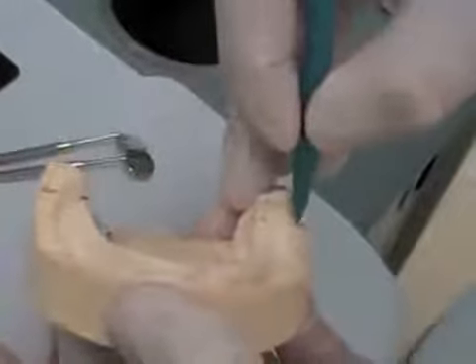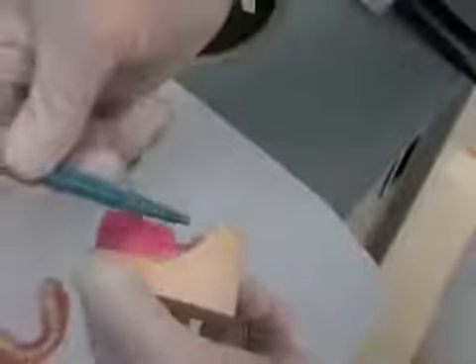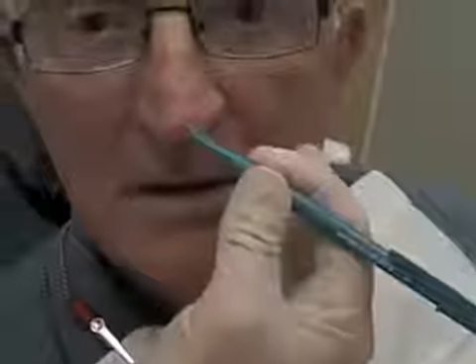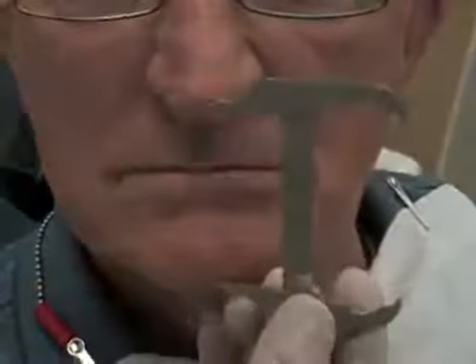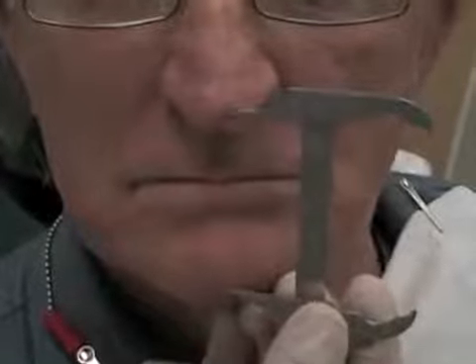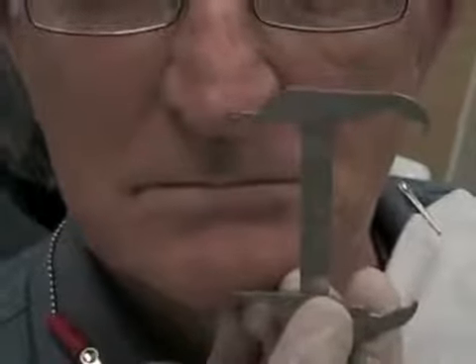Here we're marking halfway up the retromolar pad and transferring it onto the land area. We'll reseat the wax rim on the cast and use an instrument such as a pen or a ruler to make sure it lines up. To make measurements of the occlusal vertical dimension, put very discrete dots on the patient's chin and on the tip of their nose in order to use your Willis gauge to make the measurements of both physiologic rest and the occlusal vertical dimension.